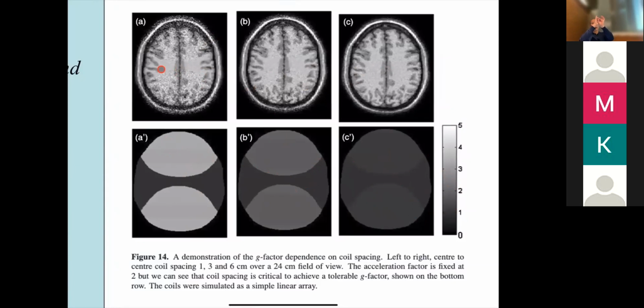So part of our coil design is how do you get the coils to see sort of the same thing, but just in a small region. You have these overlapping coils that see enough, there's enough overlap, because if there's no overlap, and neither coil sees anything here, then it can't reconstruct that. So there has to be enough overlap so they see some of it, but they can't have too much overlap, okay?